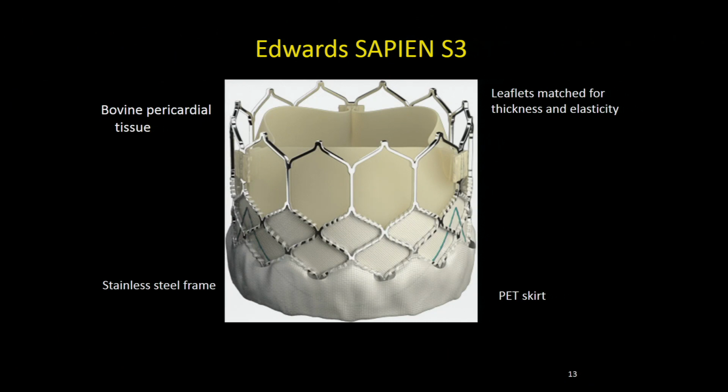And this is balloon expandable, so it goes in compressed. It's about the size of your pinky finger when it's going in through the transfemoral approach. Once we get it in place, we inflate a balloon and then deflate the balloon, which expands the stent. Once the balloon is deflated, the valve starts to work. It's a lot like a coronary stent procedure, if you've ever seen that, just on a much greater scale. A coronary stent is often about 3 millimeters in diameter. These are usually 26 millimeters in diameter, on average.